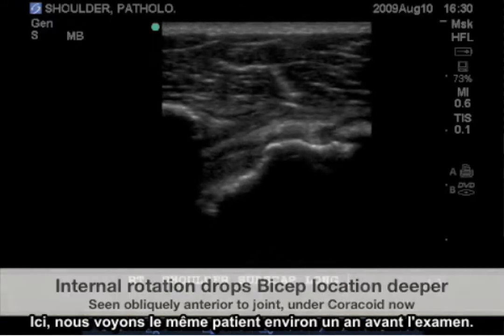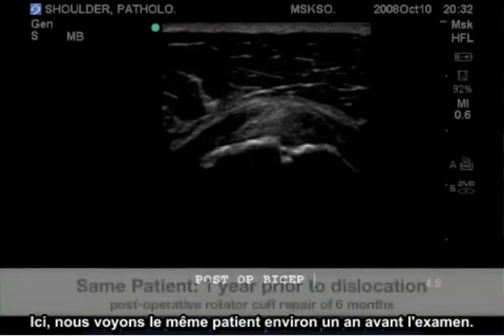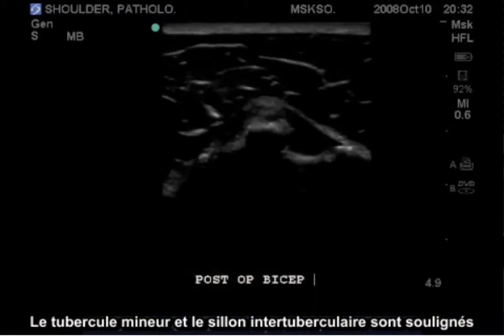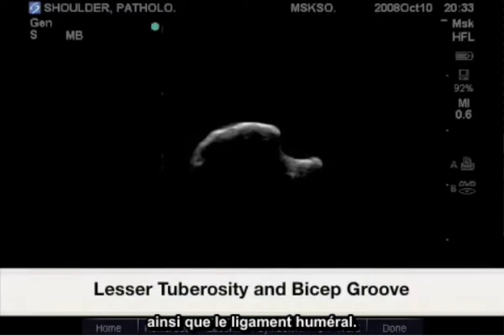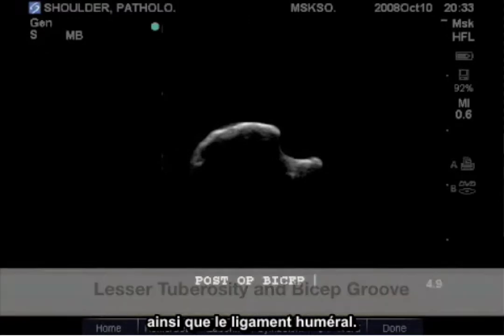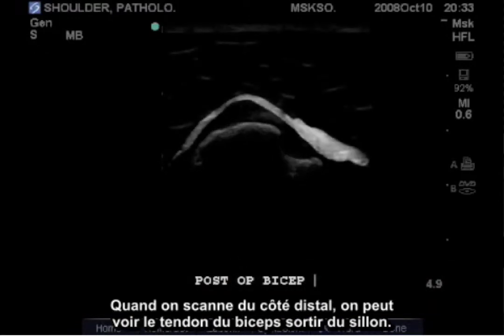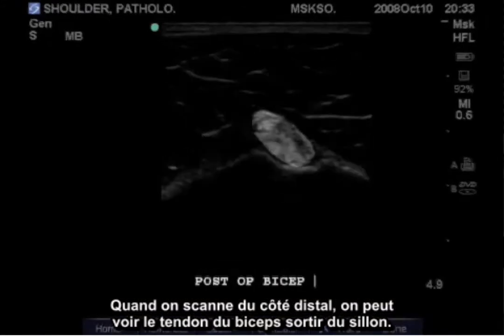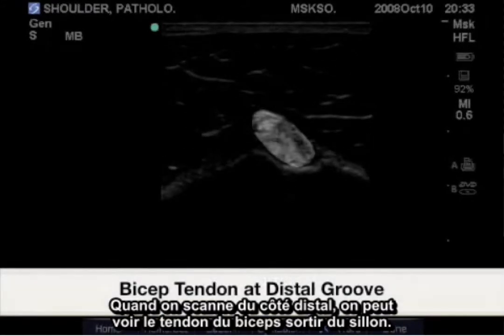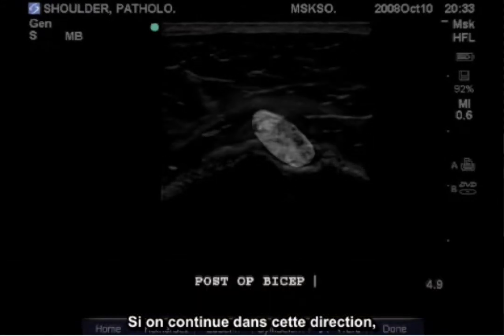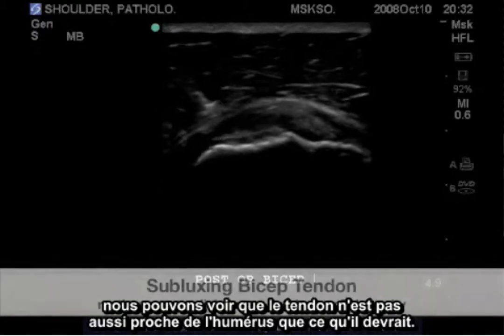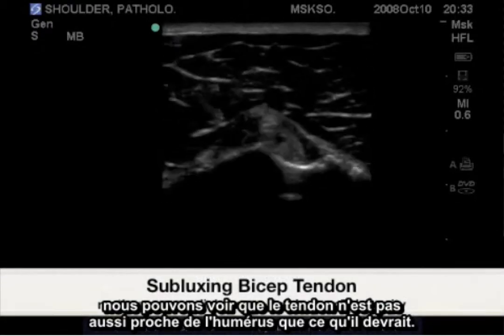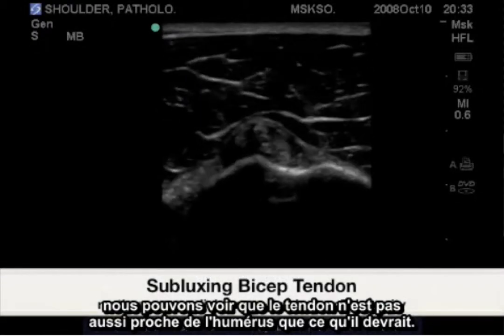Here we have the same patient approximately one year prior to the exam. Highlighted is the lesser tuberosity, the bicep groove, and also the transverse humeral ligament. As we scan distally, we see the bicep tendon subluxing out of the groove. Scanning even more distally, we see the bicep tendon not quite anchored as closely to the humerus as we would like to see it.